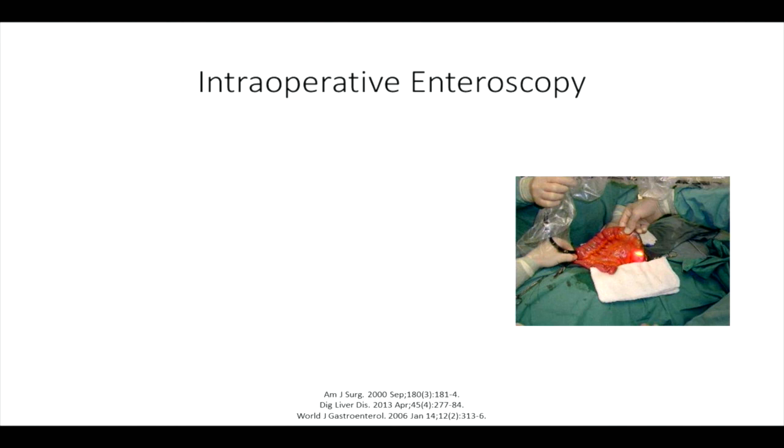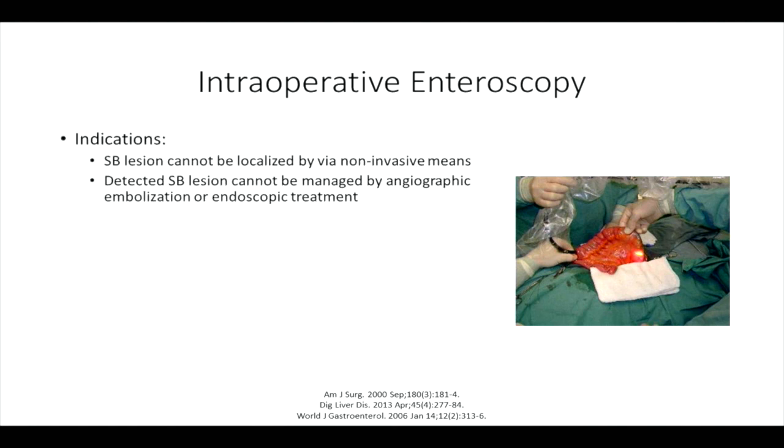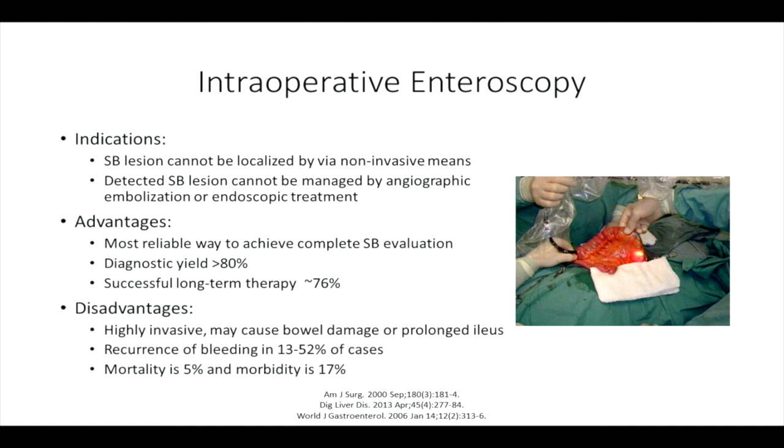Of course, if all else fails, we can go to intraoperative enteroscopy, which I'll skip through relatively quickly, and it's not our favorite because it is relatively very invasive. Still, there is a recurrence rate and it has a high mortality and morbidity.